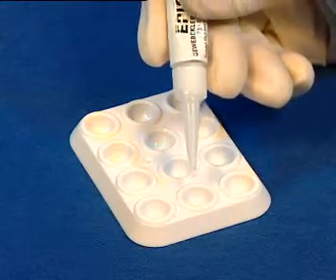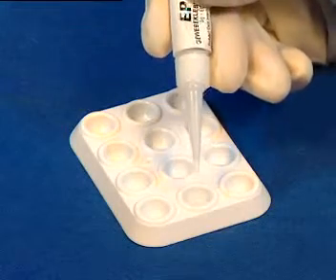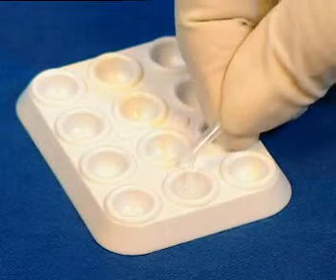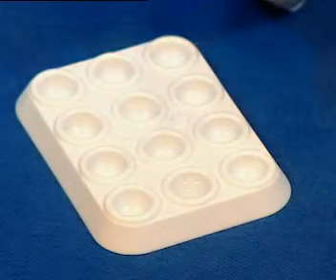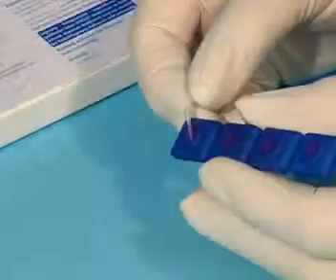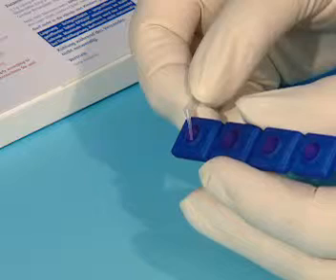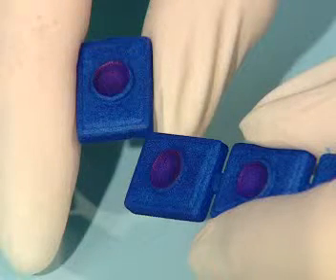Now 1 to 3 drops are placed into one of the depressions of the pallet and soaked up with a dispensing pipette. This allows for an exact application of the adhesive. The pallets are replaced by the new drop-in trays. One tray has to be broken off, filled with the adhesive and thrown away after use.